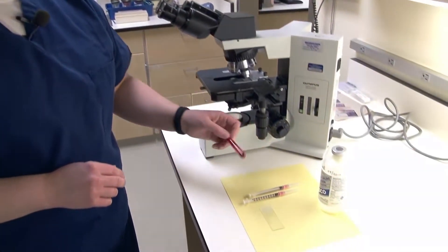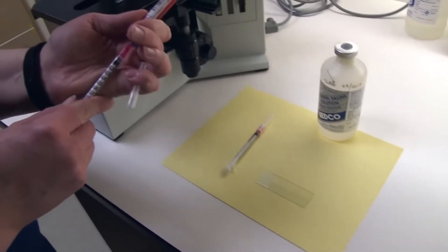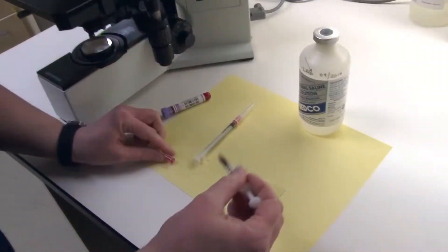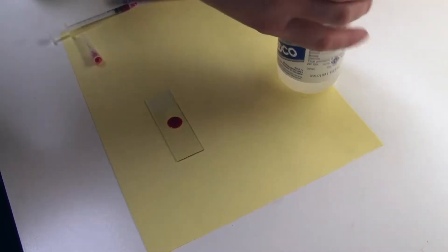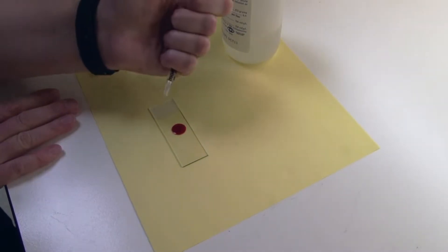I'm going to start here with my anticoagulated blood. I'm just going to draw out a small amount and put a drop on my slide. Next, I'm going to draw a small amount of saline and put a drop of saline on the slide.